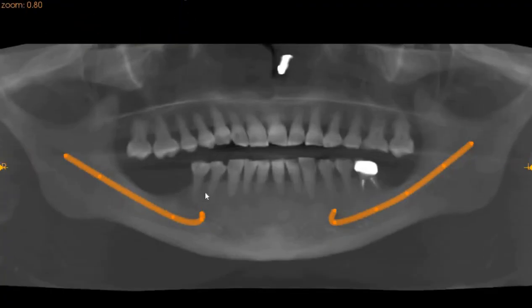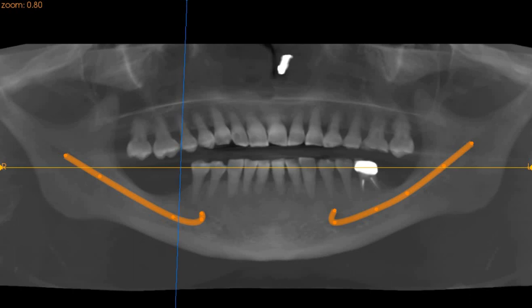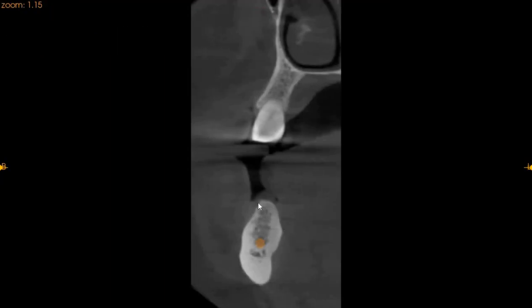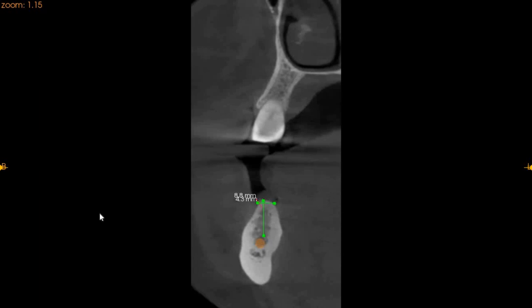On the lower right, as you can see in the panoramic view, we have the first and second molar which need to be replaced. In the first molar region there is some bone which is very close to the five, but there is sufficient bone. The ridge width is approximately 3.8 to 4 millimeters at the crest, and from the crest to the inferior alveolar nerve we have only 8 millimeters of space.